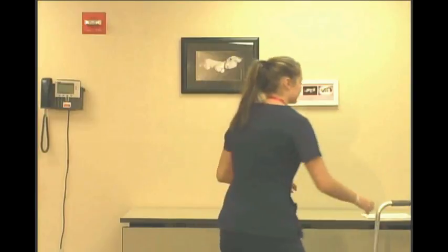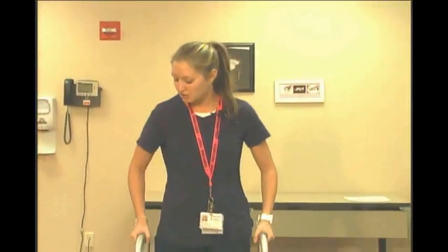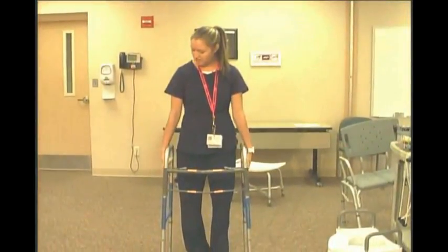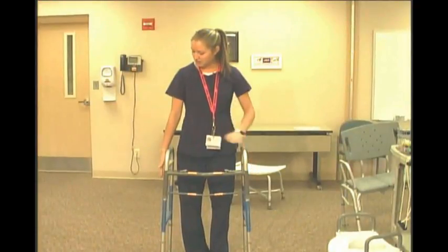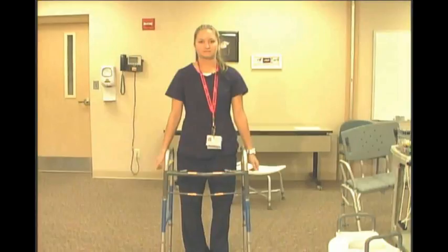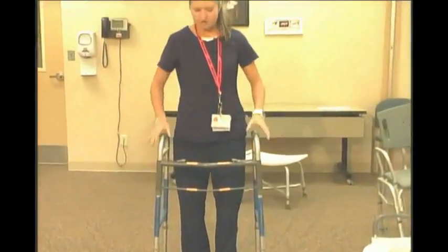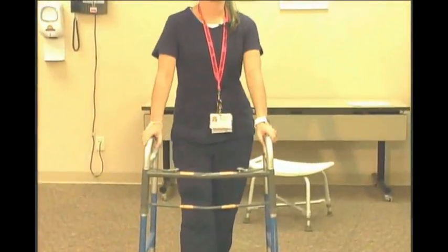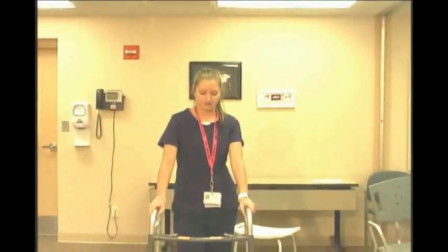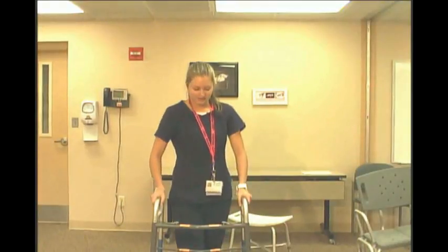One other thing I would like to mention, when you're getting your walker, as Ryan mentioned in his video, you want to make sure that it fits you correctly. So all you need to do is make sure that your wrists are at where the handle is. That's how you size it to you correctly. Okay? Most of what I've mentioned you should find in your joint class book, which you will get at your PACE appointment when you come and visit the doctor. So you can reference that book. Everything I mentioned should be in there.